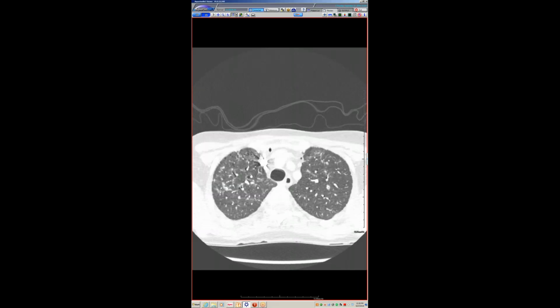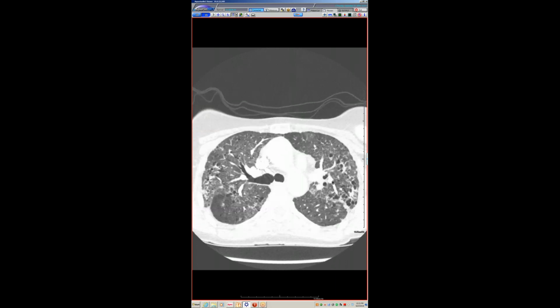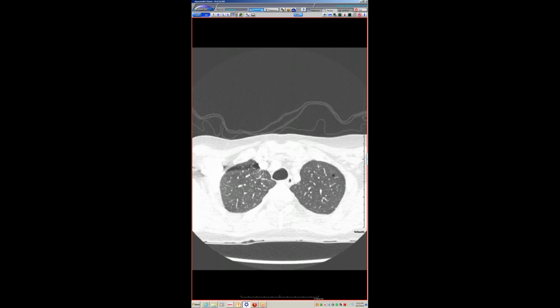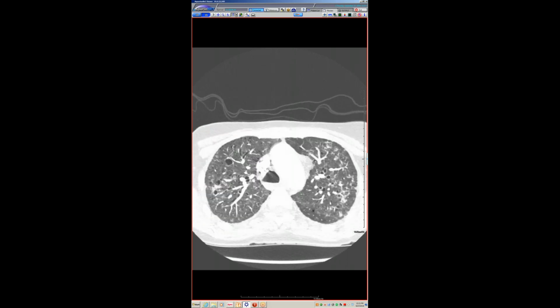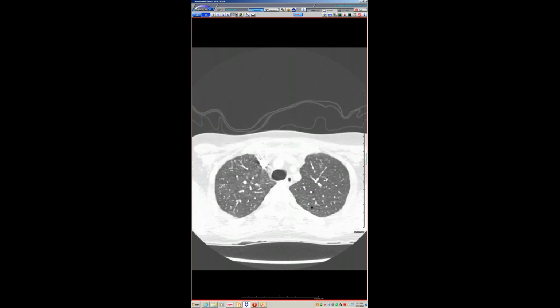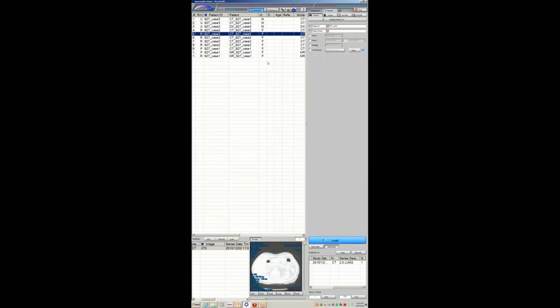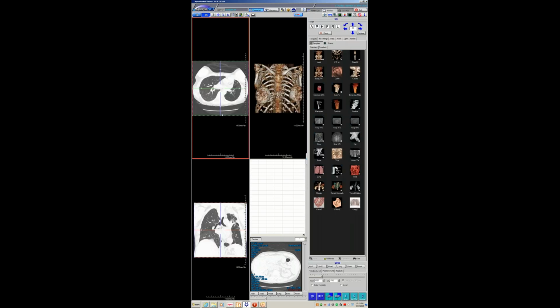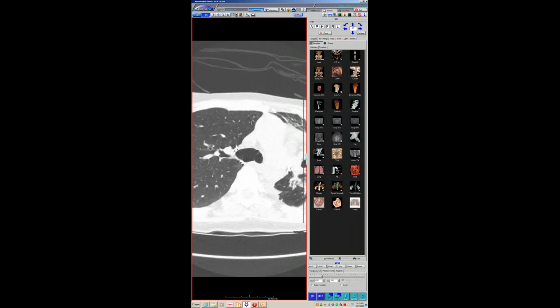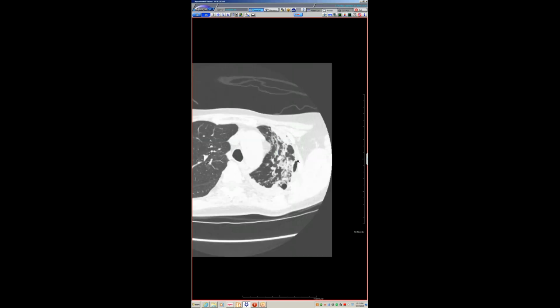Yeah, because it would be interesting to know what this process is. Right. This process here that progressed into that more confluent upper lobe fibrosis and pleural thickening. Anyways, when I first looked at her most recent study, I thought she was going to be just a recurrent sarcoid. I was thinking, oh, this is a patient who got transplanted for sarcoid and it has recurrent sarcoid in the left lung, but in fact it's not.